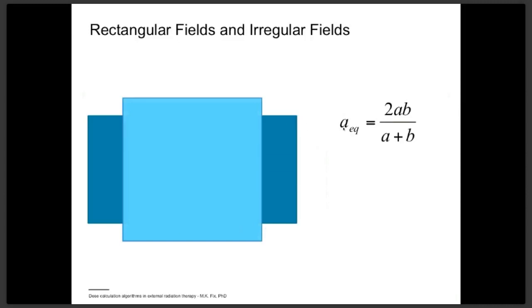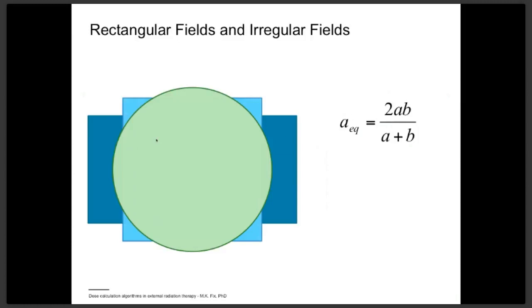This is determined by keeping the same area to perimeter ratio, and from the square field size to circular field we determine the equivalent radius, and this is the constraint that we want to keep the same area of the two field sizes.